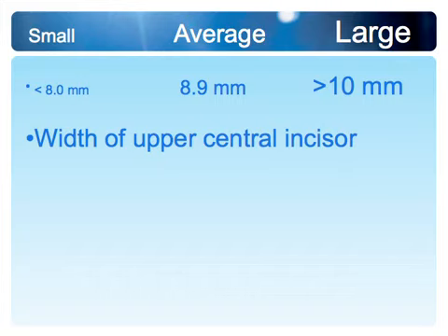So I love to measure the width of the upper central incisors because I like to know if I'm dealing with an average tooth. If I'm dealing with a 9 millimeter central incisor, fantastic. The good news is that's the majority of the population. In the bell curve of society, most people have the average. And then you have that percentage that has large teeth and the percentage that has small teeth.